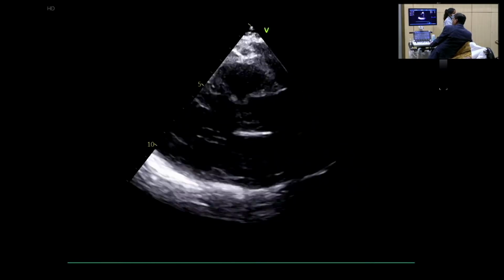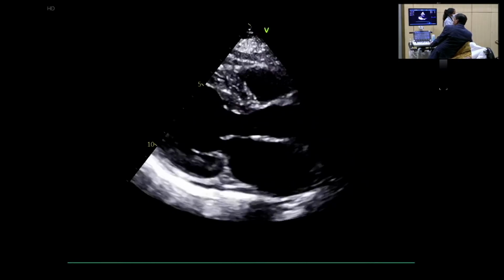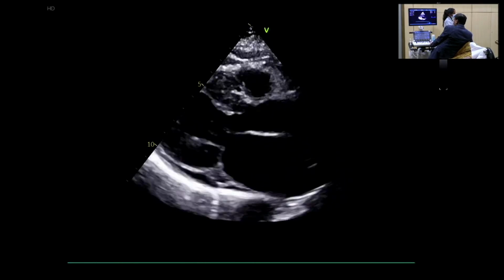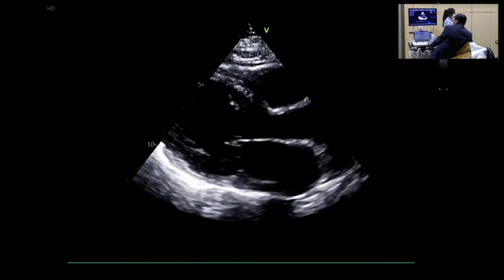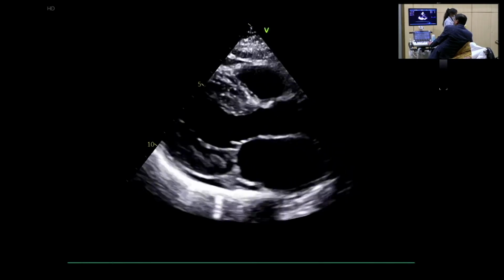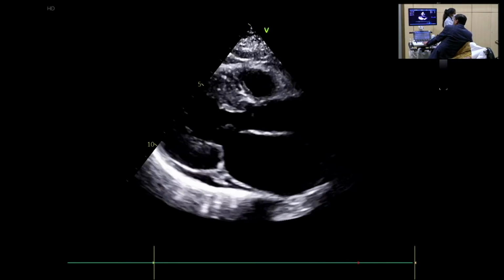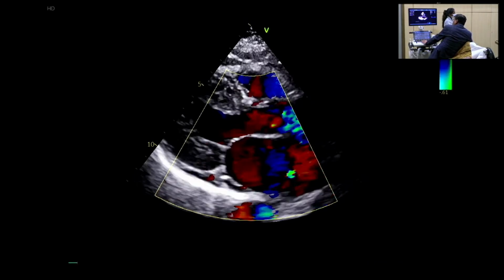So ideally it is lower down. In this patient, I would go for stenting directly. A self-expanding stent will give a very good result. So next time you come for the pediatric course again, we will show you this case with stenting.